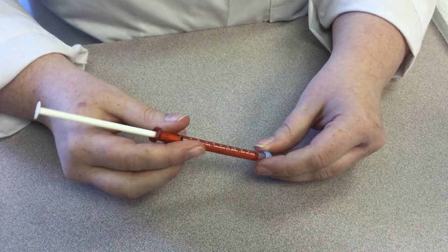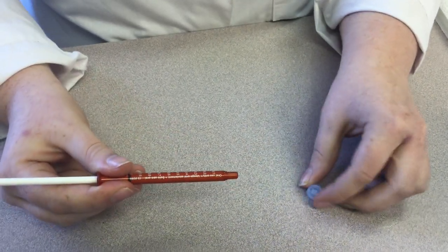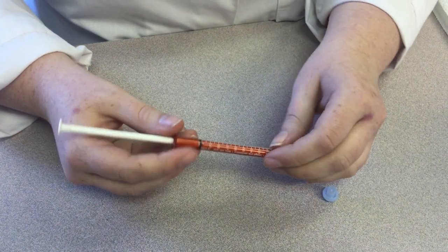To start with, you are going to wash your hands. Then you are going to remove the blue cap on the end of the syringe.